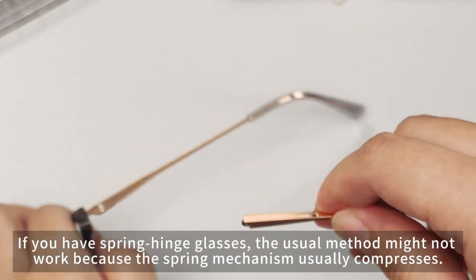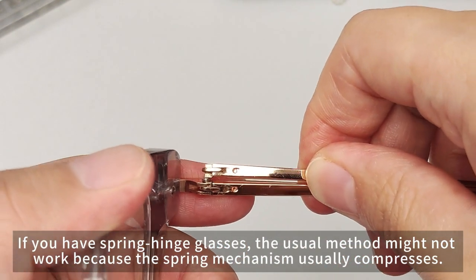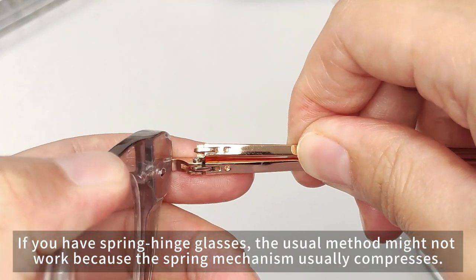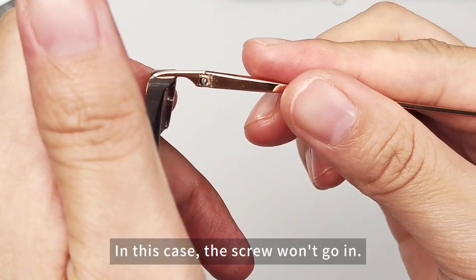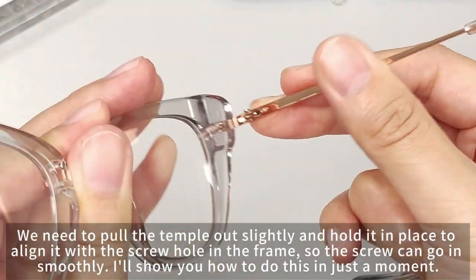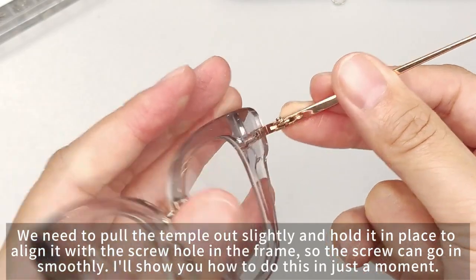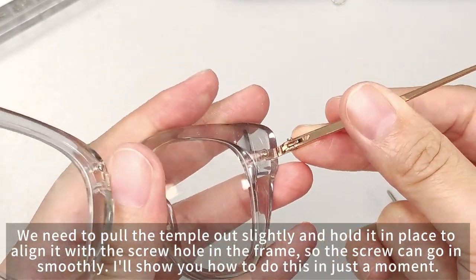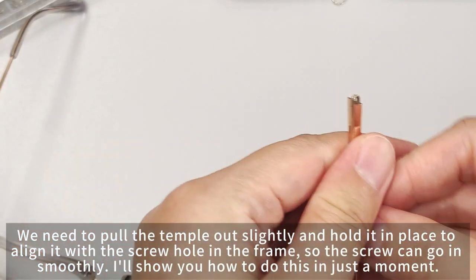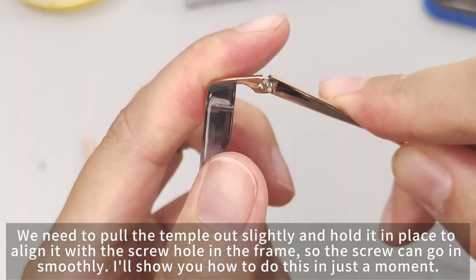If you have spring hinge glasses, the usual method might not work because the spring mechanism usually compresses. In this case, the screw won't go in. We need to pull the temple out slightly and hold it in place to align it with the screw hole in the frame so the screw can go in smoothly. I'll show you how to do this.